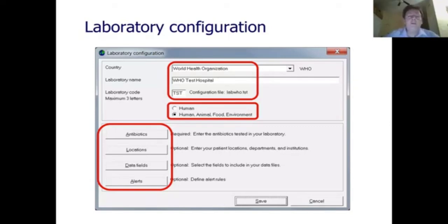And finally, alerts. WHONET has a list of 190 alerts. There are alerts such as important species, important resistance, and quality control. There's high priority alerts such as Neisseria meningitidis is important. Salmonella typhi, these are high priority alerts. MRSA, VRE, ESBL are medium priority alerts. And Klebsiella pneumoniae sensitive to ampicillin is a low priority alert, which is more quality control and educational in manner.